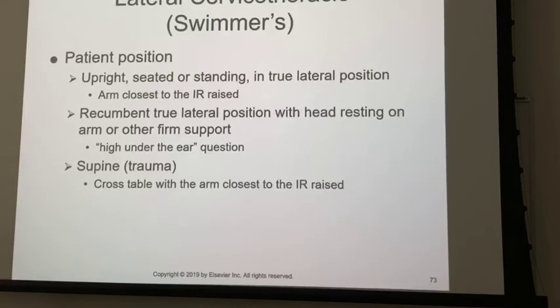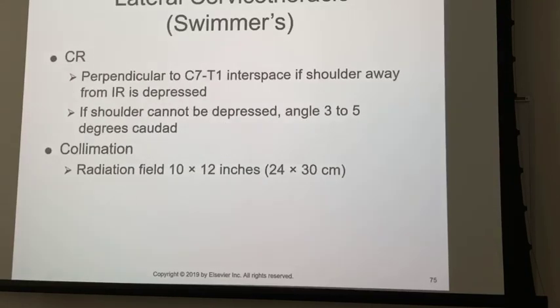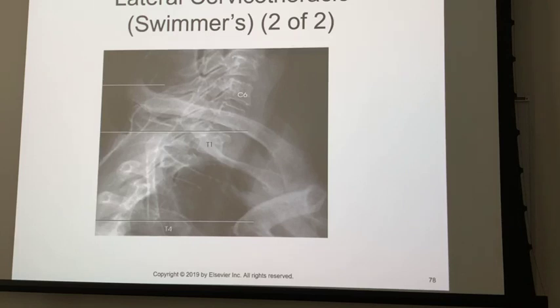And I mean that literally. You might be able to see it. It's an ugly image. It's an ugly, ugly image, but sometimes it's all we can do to see the anterior alignment of C7-T1. Okay? So, it looks like that. Yuck, right?